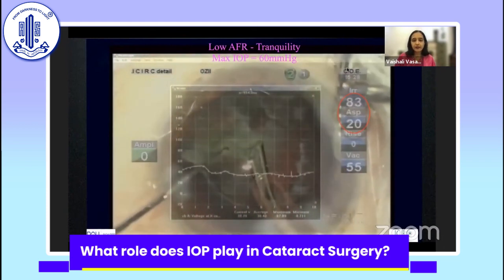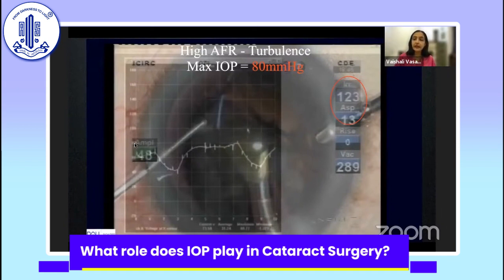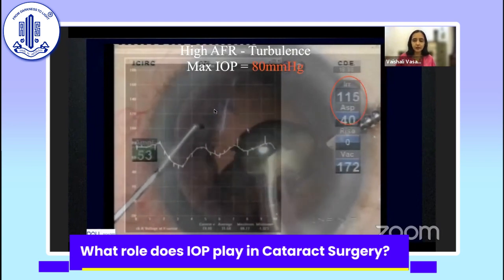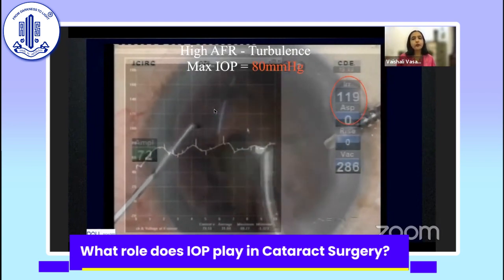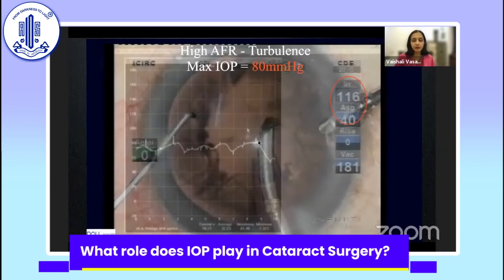Now with the bottle height raised to 110 cm — an irrigation pressure of about 120 — and a flow rate of 40 cc/min, the IOP cursor is at 60 mmHg at the lower mark and 80 mmHg at the upper. The pressure is already at 80 mmHg, and as the video plays you can see much more up-and-down fluctuations. The fragment disappears faster but is less controlled, tending to fly around, with IOP swinging between 50 and 80 mmHg repeatedly.